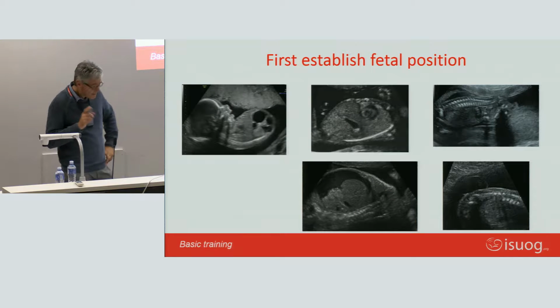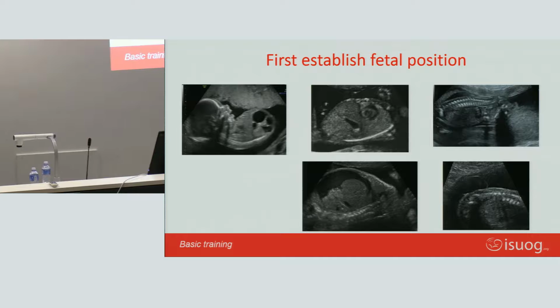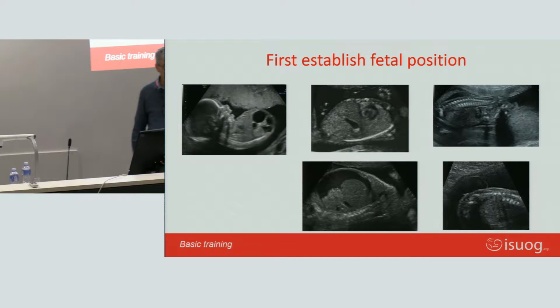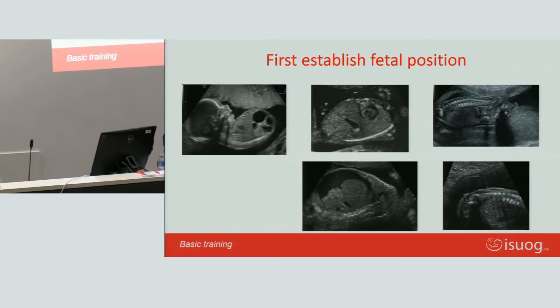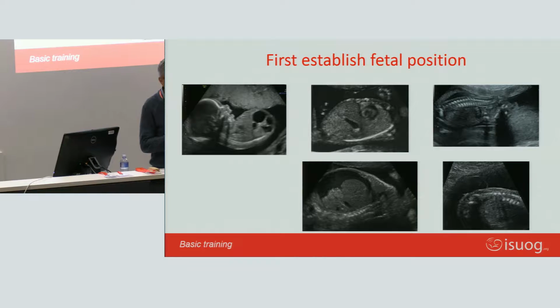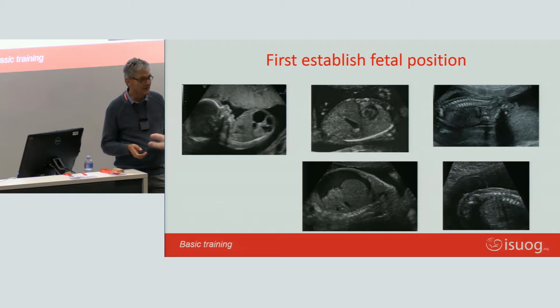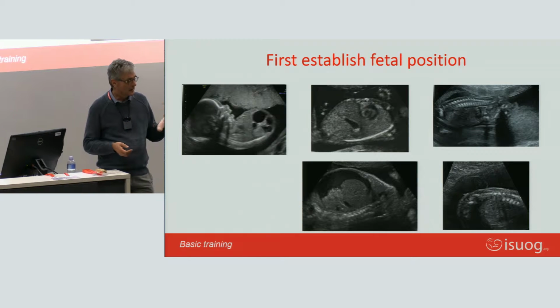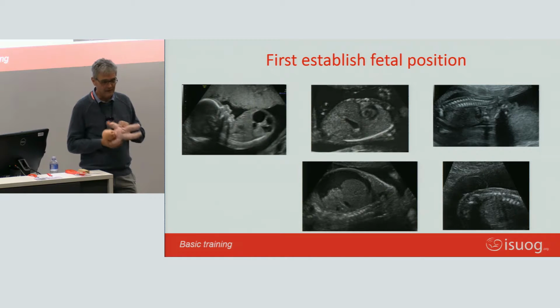Right. So again, firstly, and you've heard that before, work out how the baby is lying. And have little Poppy next to you because she's going to teach you how to scan. And you've heard this morning, it says, hello baby, are you alive, where are you? And then figure out, how is this baby lying in the mom's tummy? Is she lying like this? Is she lying like this? Is she lying like that?